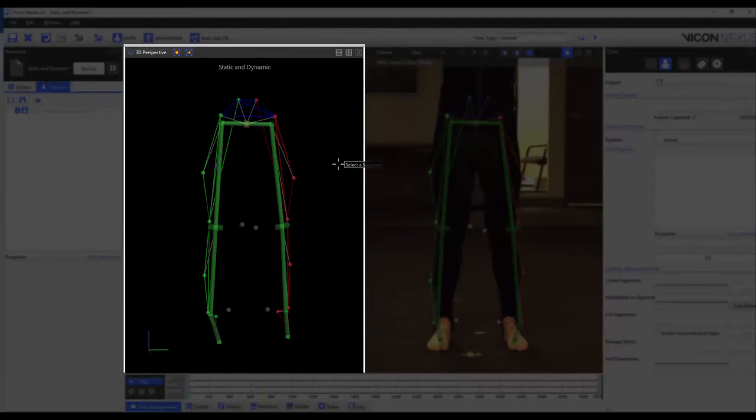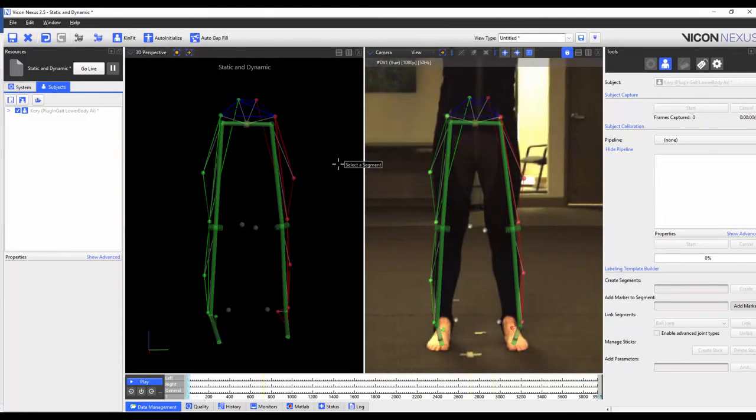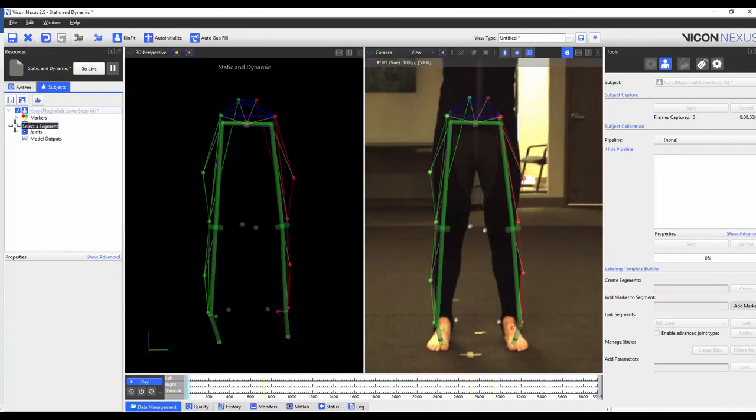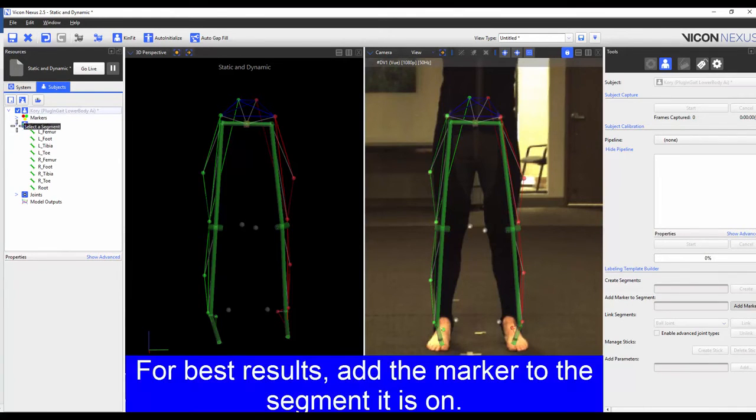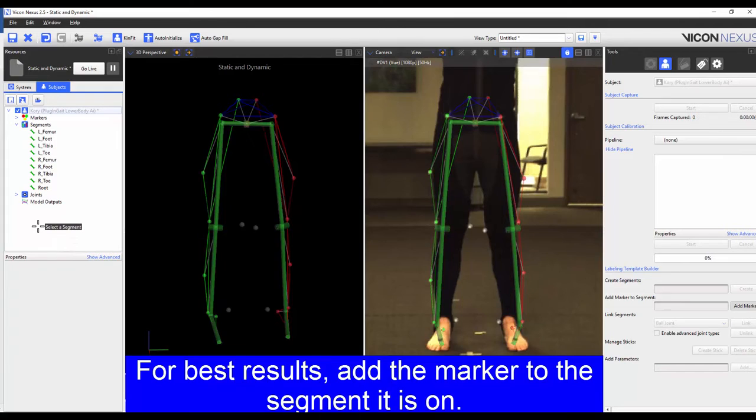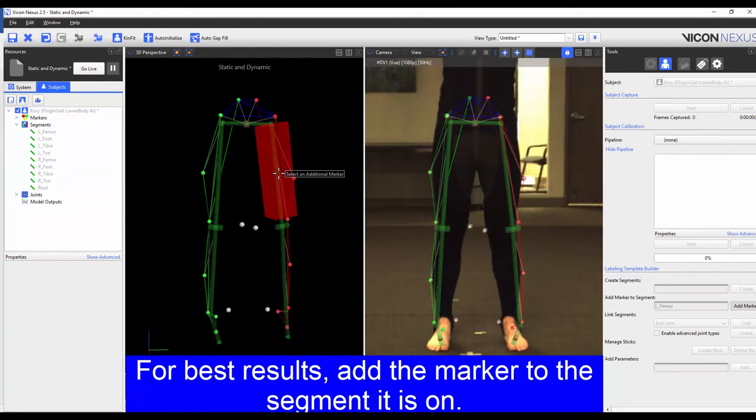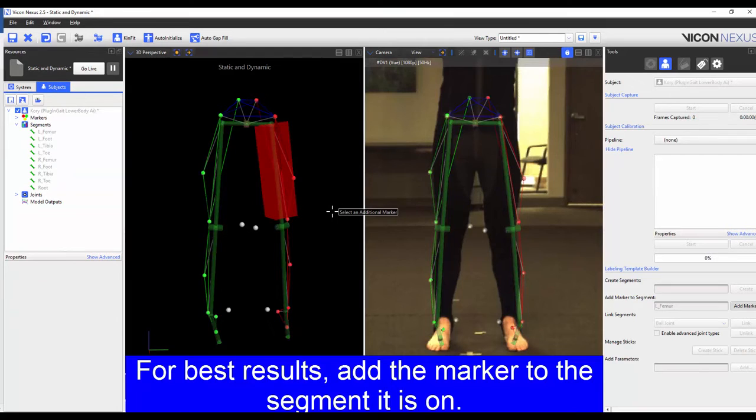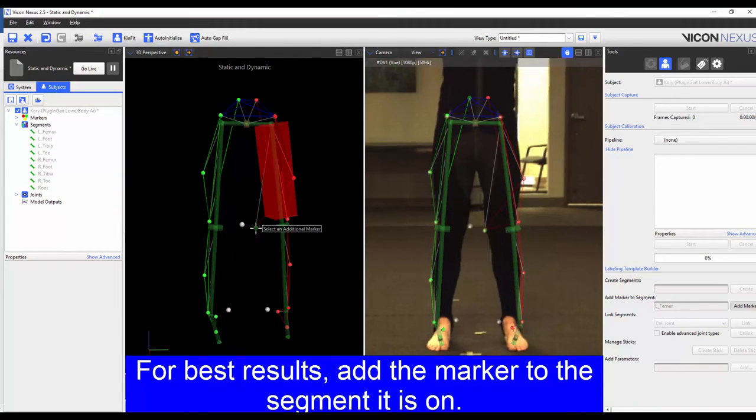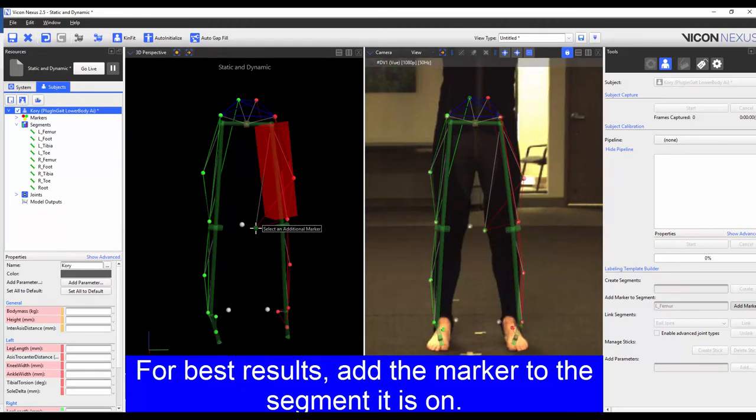We can either choose the segment from the 3D perspective or through the segments list in the resources pane subjects tab. The first marker I'm going to add is the left medial knee marker. I'm going to place this in the left femur segment, and so I select the left femur segment in the 3D perspective. This then prompts me to choose the additional marker and I choose the corresponding marker. To finish the process for this marker I press add marker again.